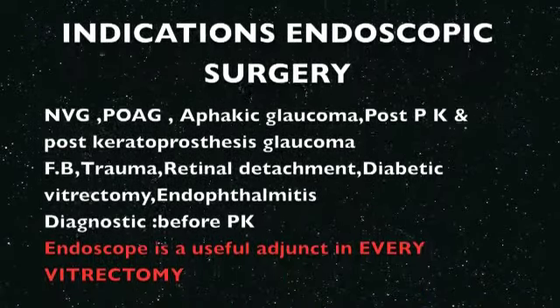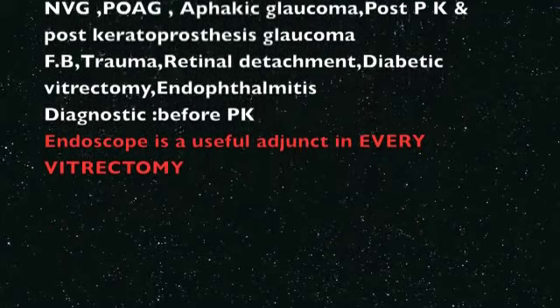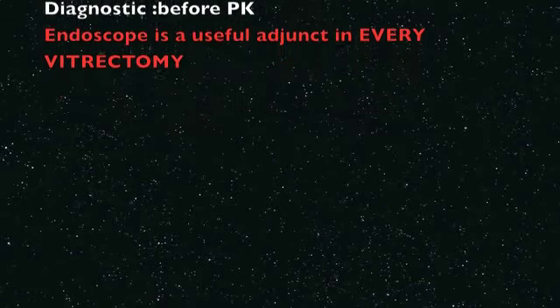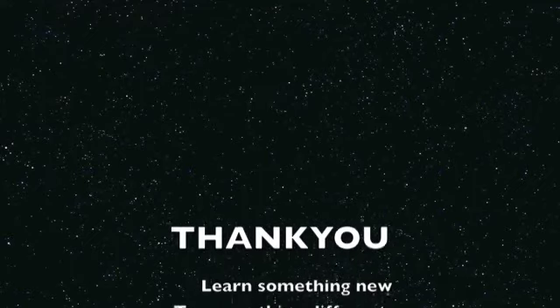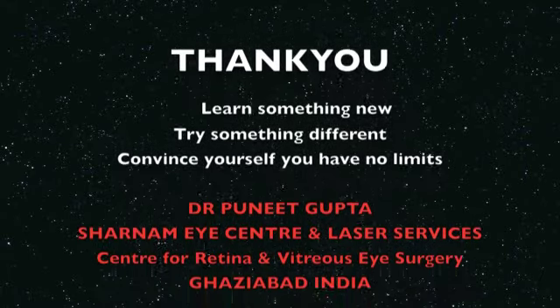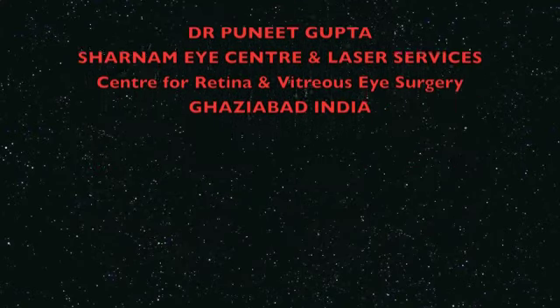There is definitely a learning curve, and it takes time before one gets comfortable with the lack of stereopsis and shifting perspective. It allows excellent visualization of the region behind the iris as well as the vitreous in eyes with opaque media. Looking towards the future, no one can say what further applications will be found for endoscopy, but it is a useful tool with great potential for innovative uses.